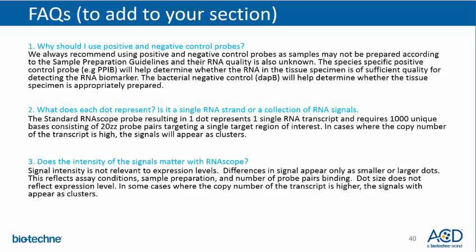Okay, so another question that just came up is whether target expression that appears as clusters, whether that's possible, and whether it will interfere with data analysis. Well, in cases where the copy number of the transcript is high, these signals can appear as clusters. What is important is that for the quantitative analysis of the number of dots by the HALO software, the parameter can be set to determine the dot size and diameter for detection.